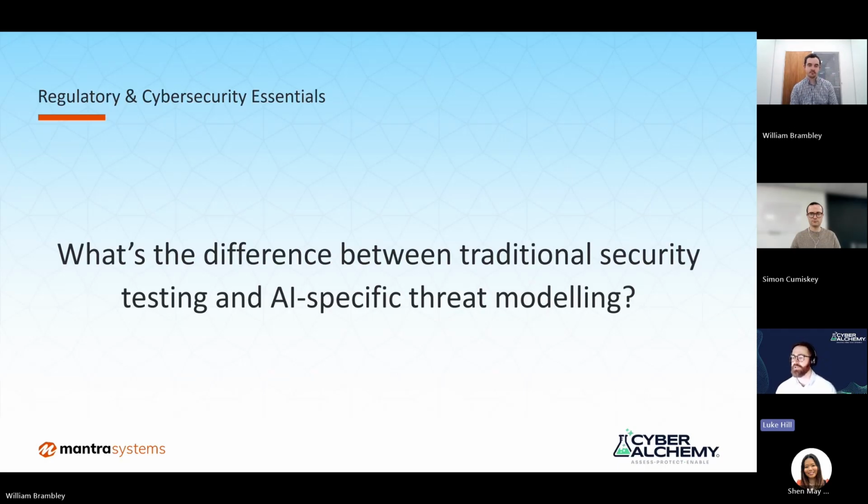So you say, okay, for this threat that we identified, the risk of somebody guessing a user's password in this system, we're going to limit, as a control for that risk, the number of incorrect passwords to 5 submissions. Then the account will be locked out after 5 submissions or something. And as part of the security validation at the end, it's the job of the penetration tester, a cybersecurity consultant, to say, okay, has that control worked?